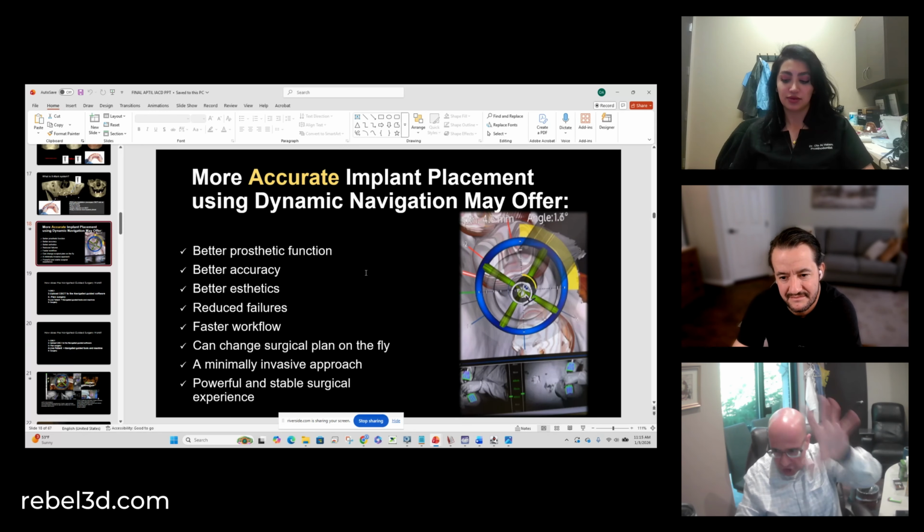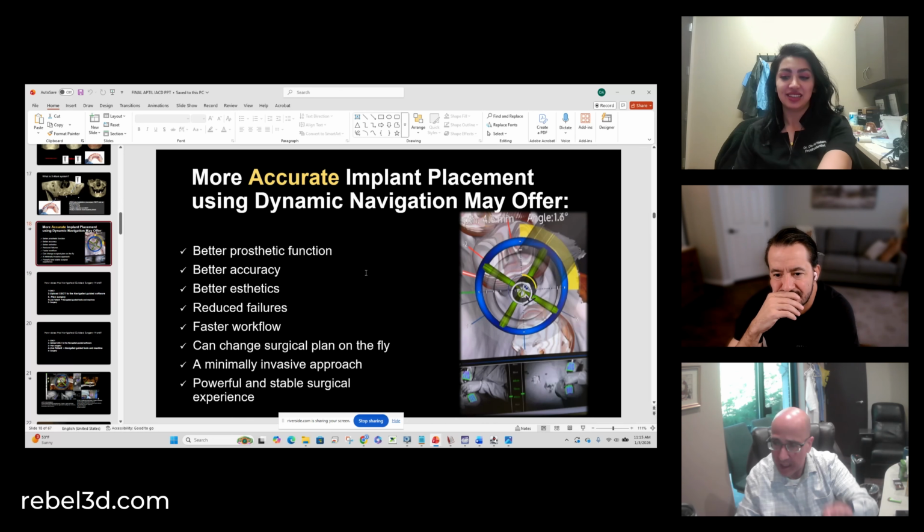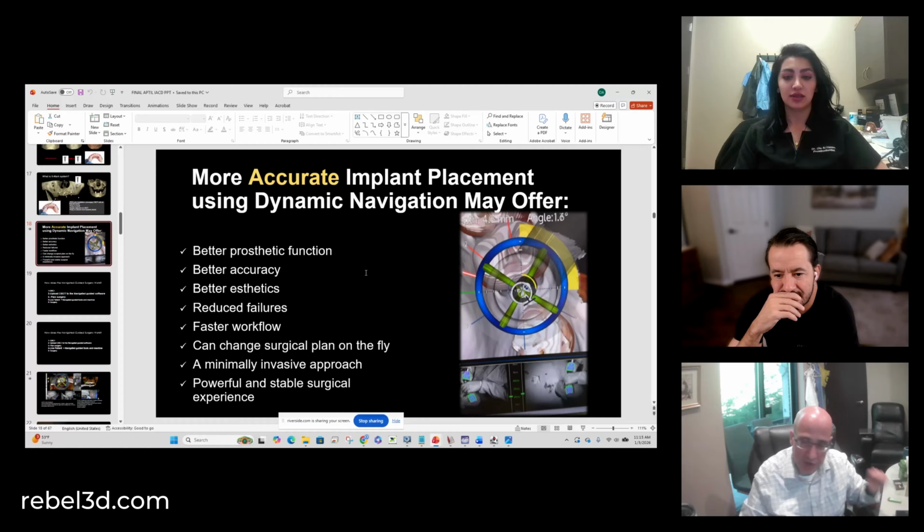before I start my planning, right? Then she comes to me, hey, Mounir, this is FP1. Why, Ola, FP1? Because we don't have enough bone, blah, blah, blah. This is my justification. This is the picture. So plan your surgery FP1. I need the implants to be placed in an FP1 position.